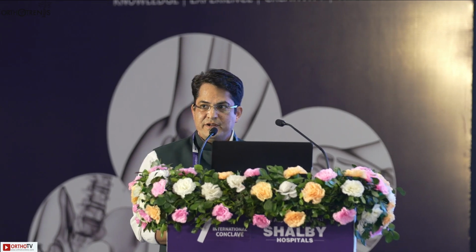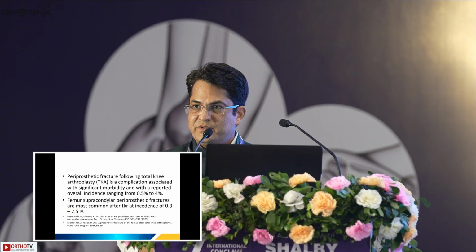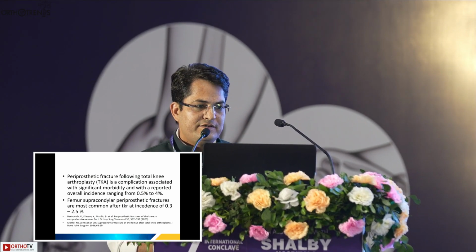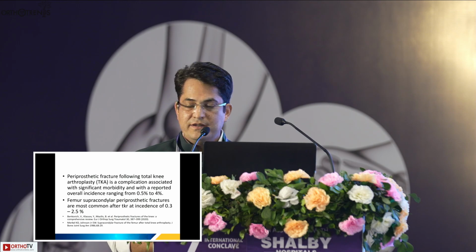The topic is revision in periprosthetic fractures. As we all know, the periprosthetic fracture is a nightmare for the patient as well as for the surgeon, because it creates significant morbidity for the patient, who usually comes to us for a better quality of life after TKR surgery. The overall incidence of periprosthetic fracture is 0.5 to 4%, and femoral supracondylar periprosthetic fractures are more common than tibial.